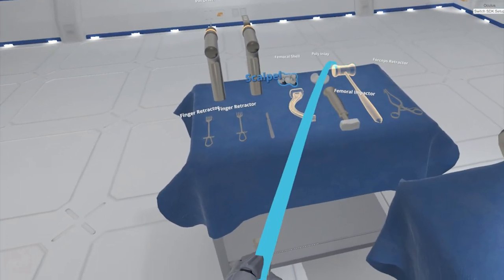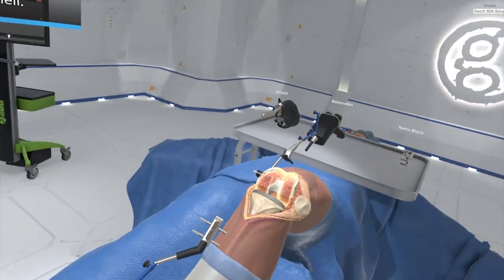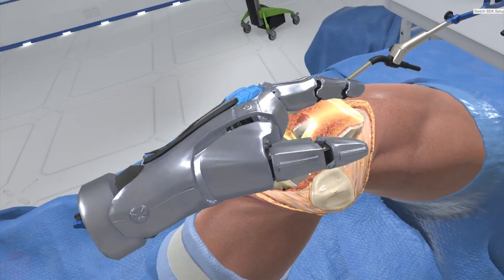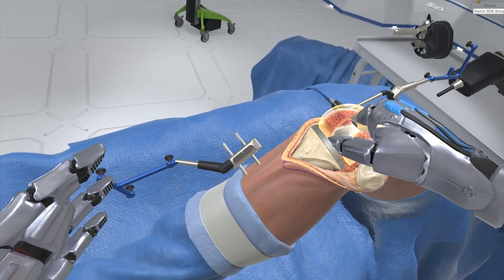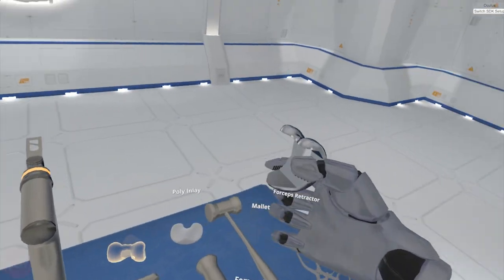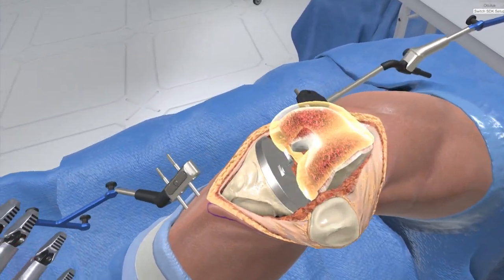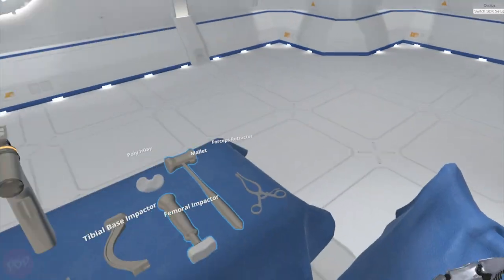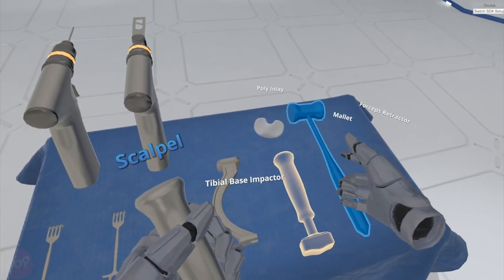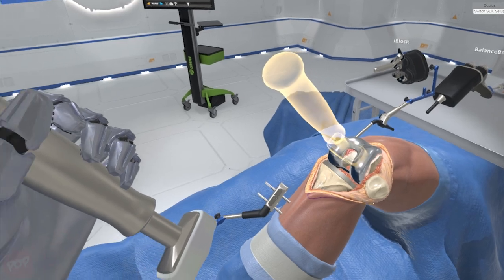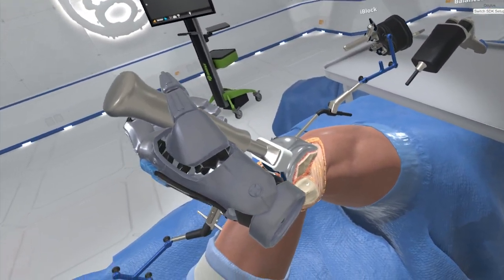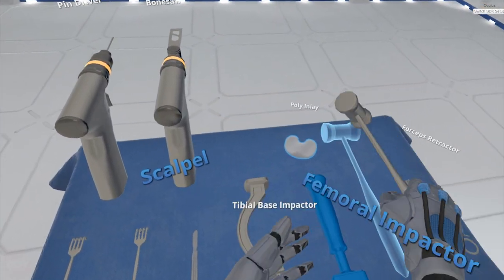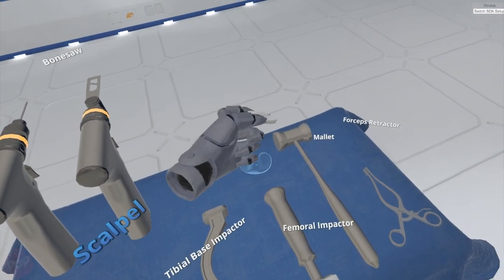Pick up the femoral shell and approximately place it onto the prepared distal femur. Select the poly-inlay. Grab the femoral impactor and mallet from the Mayo stand. Insert the poly-inlay into the tibial base.